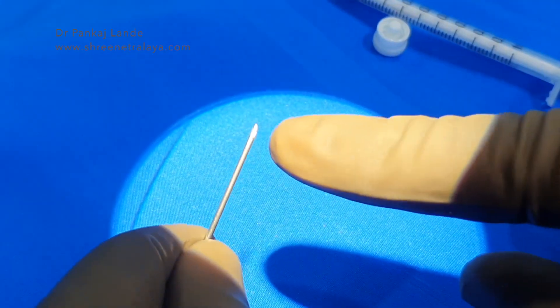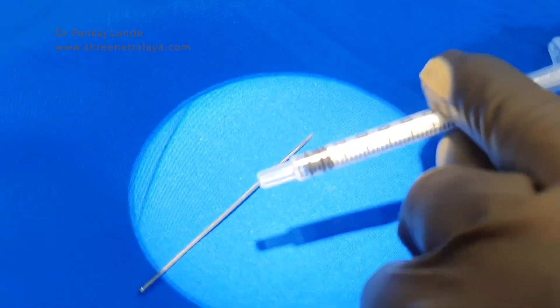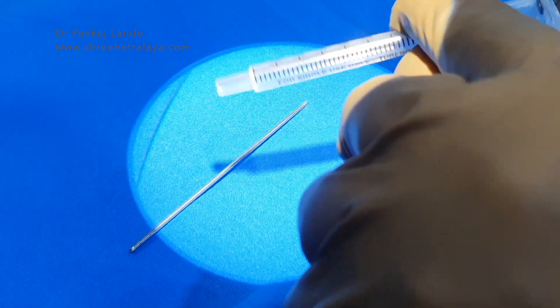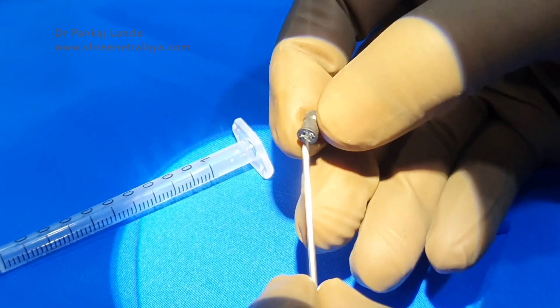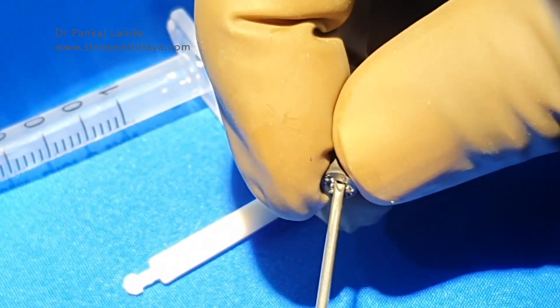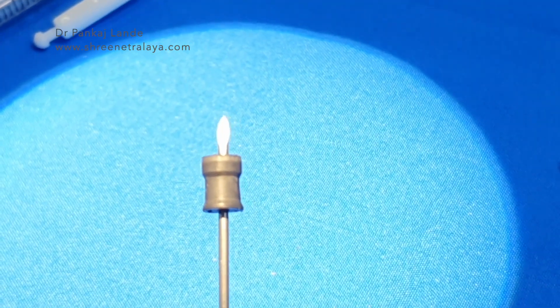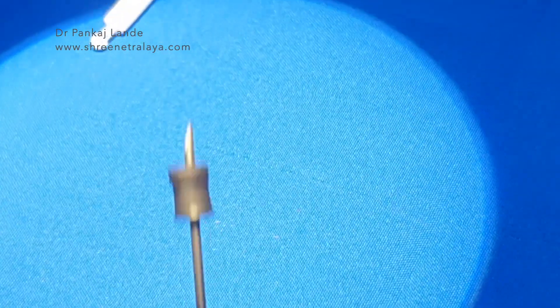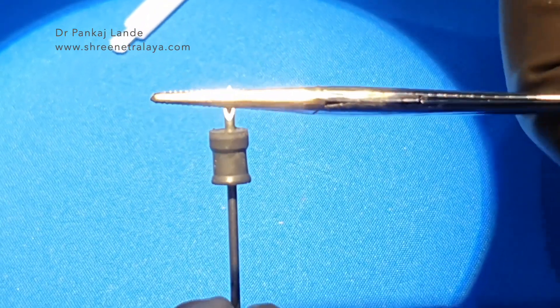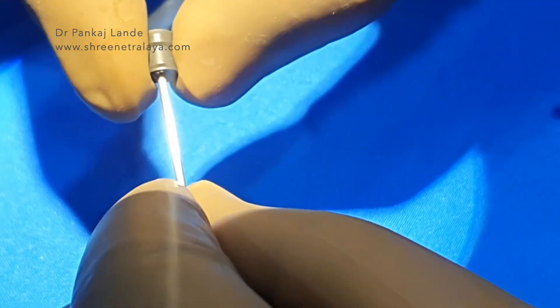Now take the 1ml syringe, take the plunger out of it, and the front rubber stopper is taken out. This rubber stopper will help us attach the metal injector to the piston of the 1ml tuberculin syringe. Just pierce the tip of this metal into the rubber stopper and then bend it so that it will lock there. Once bent and locked, this rubber stopper is attached to the piston of the 1ml syringe.